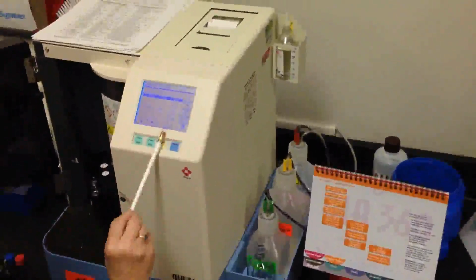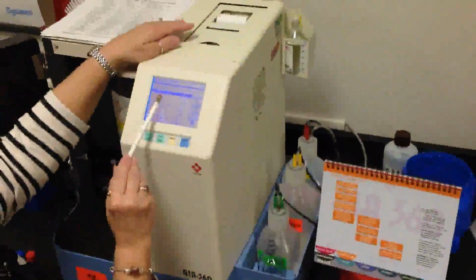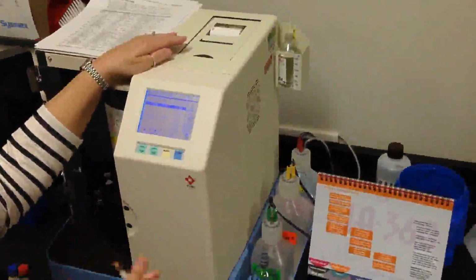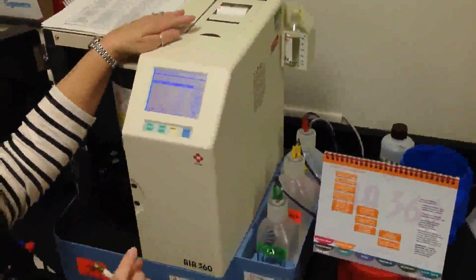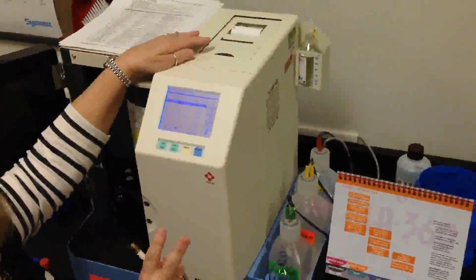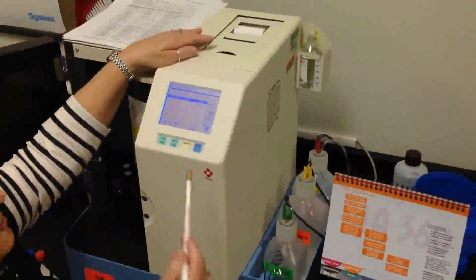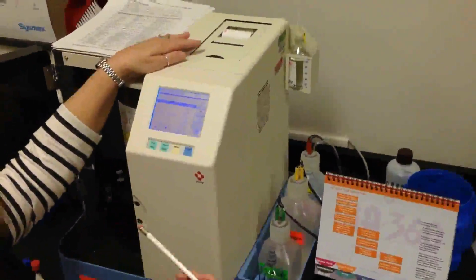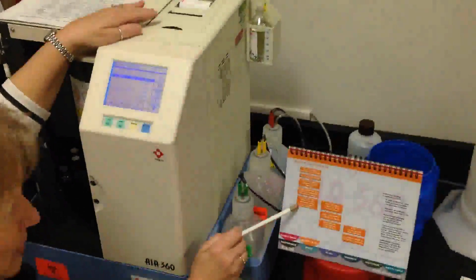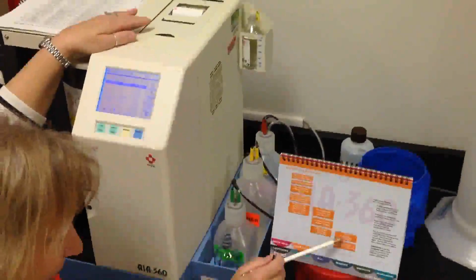Here is all the reading that is on my printout. First calibrator, second calibrator, and so on. You may only store 1 calibration per lot number of an analyte, and only 2 lot numbers of an analyte. So I can have this lot of TSH and a second lot of TSH. So if there's any more than that, I have to delete them to make a slot to place this one in. And this is what it's telling you here at this point, to omit data and make decisions and so on.